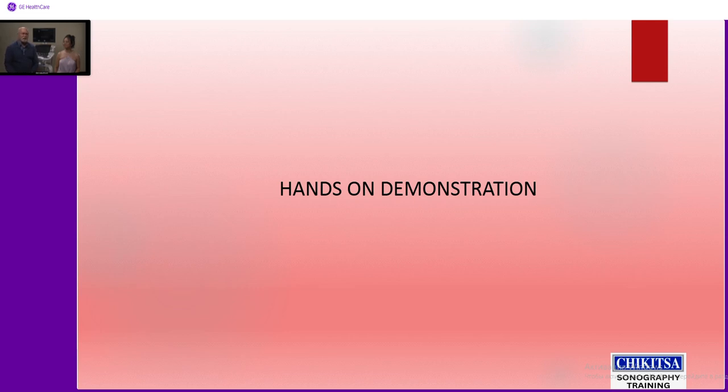Very well done. So what we're going to do now is demonstrate really one of ultrasound's greatest features, and that is its ability to assess things in motion. We're going to look at some dynamic maneuvers and where they might come into play for you as part of your examination of the shoulder.